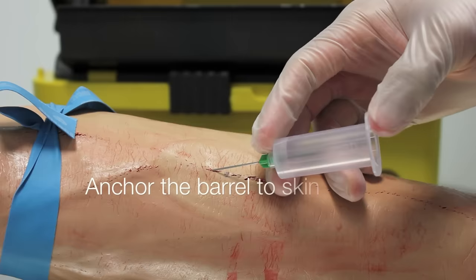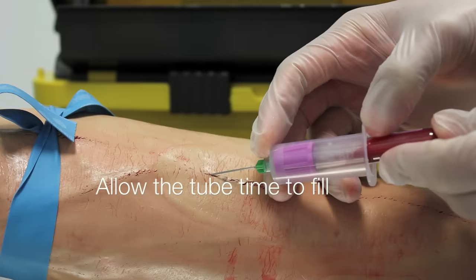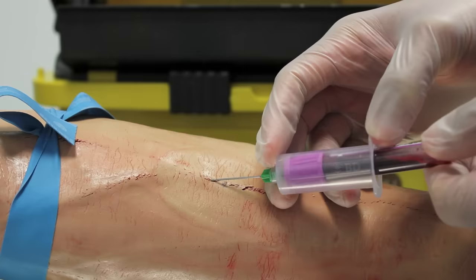Then, secure the barrel to the skin so that you're not moving it as you put the vacutainer on. Fill as many vacutainers as you need to with blood, again fixing the barrel to the skin each time you remove or replace the vacutainer.